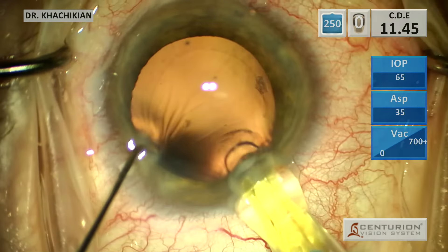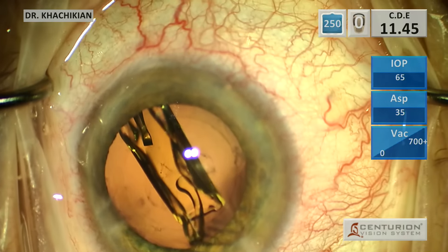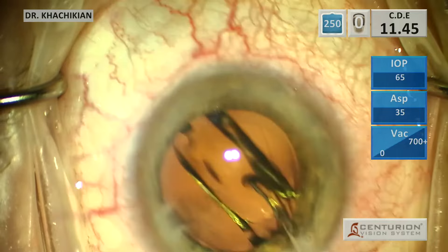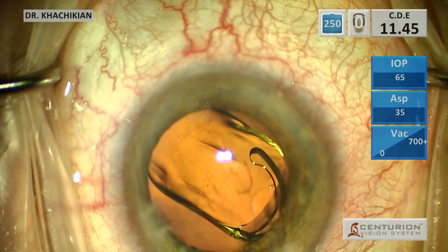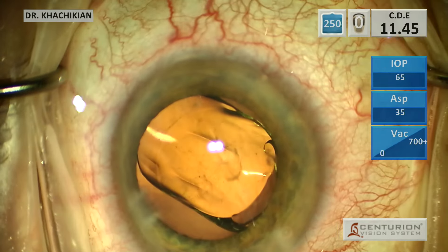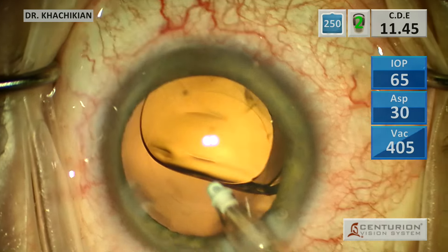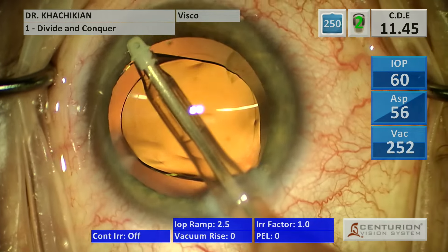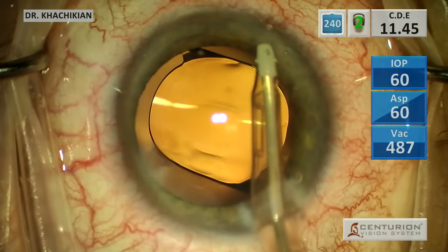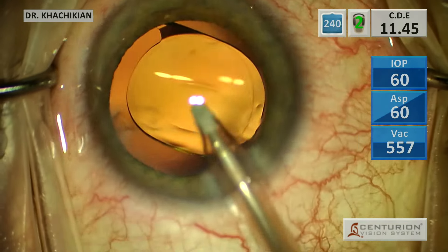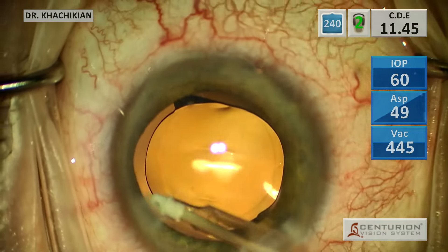All right, we'll put our lens in — it's folded nicely. I usually use the second instrument really to free up that posterior or trailing haptic, because a lot of times it is stuck on the surface of the optic and it doesn't always easily liberate itself. I do think it's because our operating room is a little colder — when it's warmer, it doesn't tend to do that. So we'll get out our ProVisc from behind the lens, and then we will sweep our angle to make sure that there is not any residual viscoelastic. We got out all our viscoelastic. If there are any LECs just sitting there, that's what we're trying to do — just get those out.